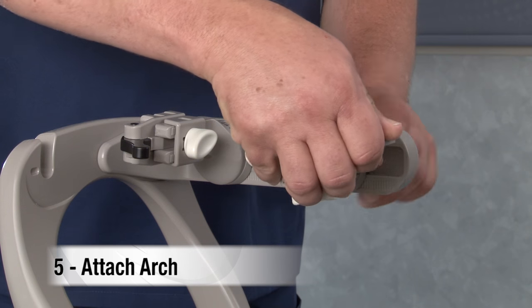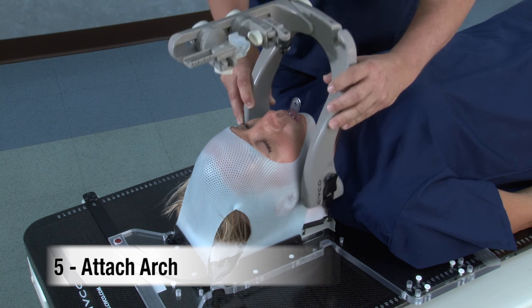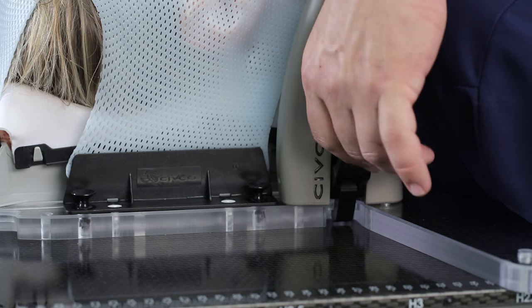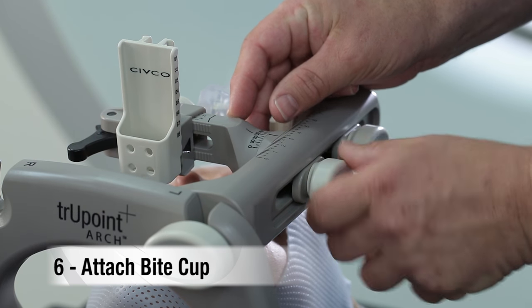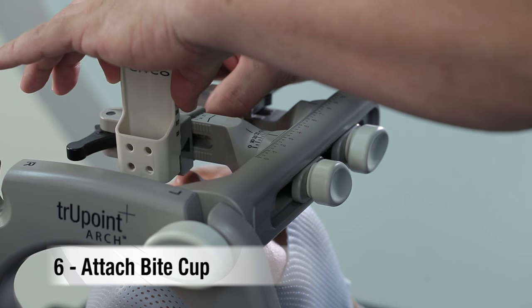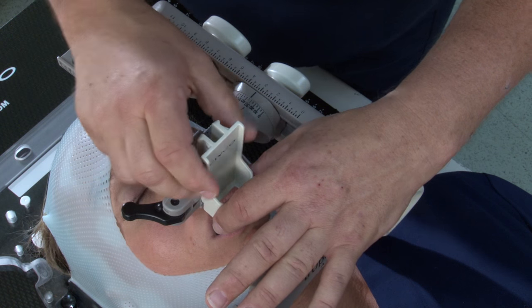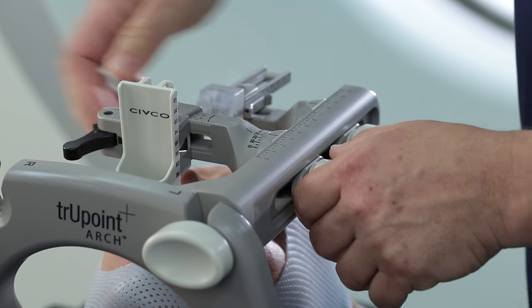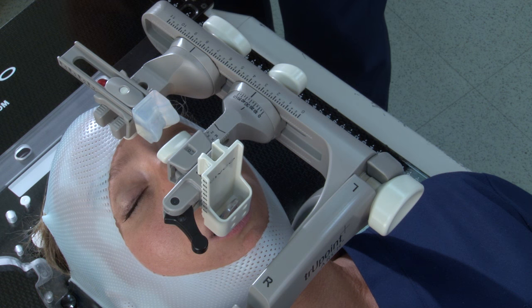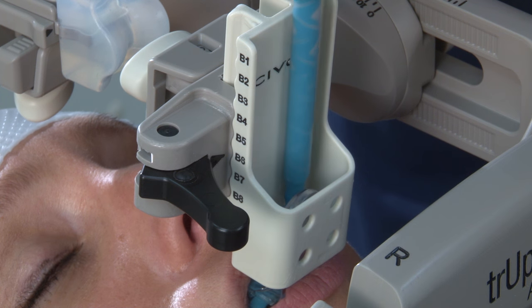Now the arch can be attached. Make sure the bite assembly and nasion piece are positioned so they will not collide with the patient. Then, insert the docking pins into the base plate and lock the arch into place. Carefully position the bite cup and place it around the stem of the bite tray. Position as close to the patient's lips as possible without touching them. Close the lever.